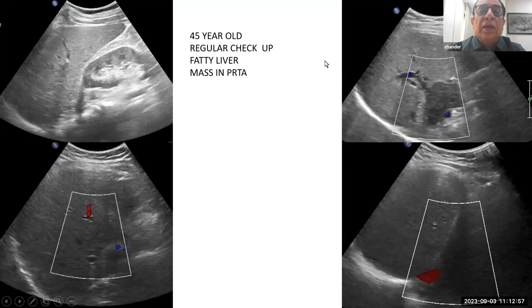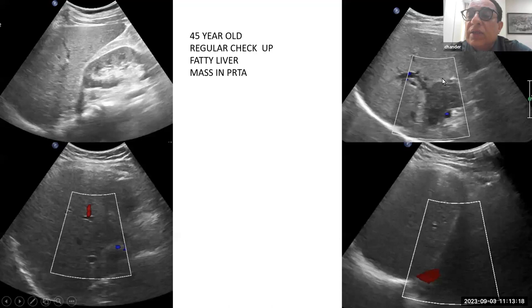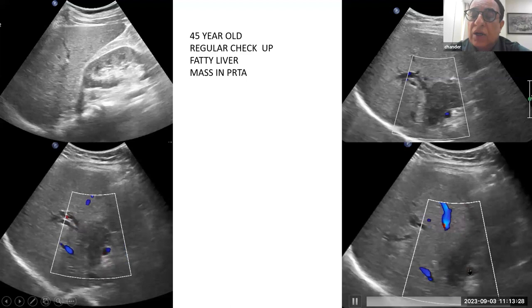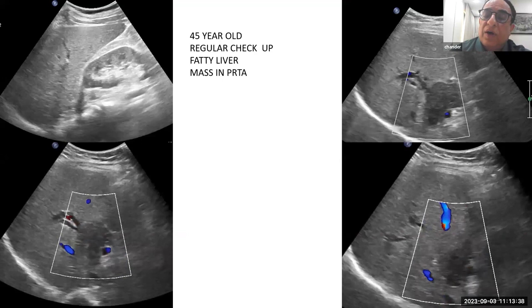Now this was a sad situation. I put this case to highlight the fact that sometimes liver disease is so silent that patients come to us at a very late stage. This is a case of fatty liver where the liver looks absolutely normal, but you can see an ill-defined hypoechoic mass at the porta — biopsy-proven hepatocellular carcinoma in a patient with steatohepatitis. Sometimes this is a very rare presentation, and this is exactly what we don't want people to land up with.